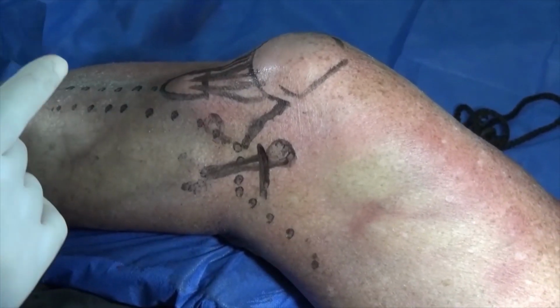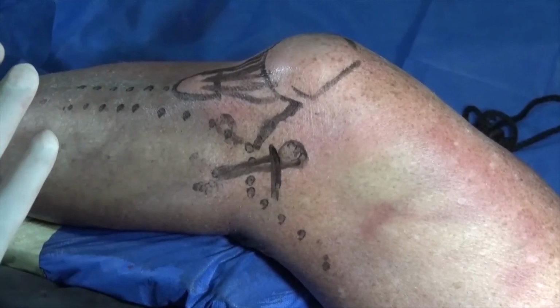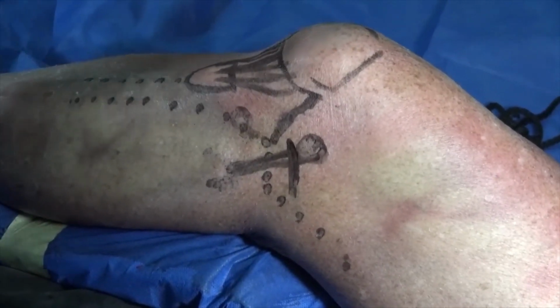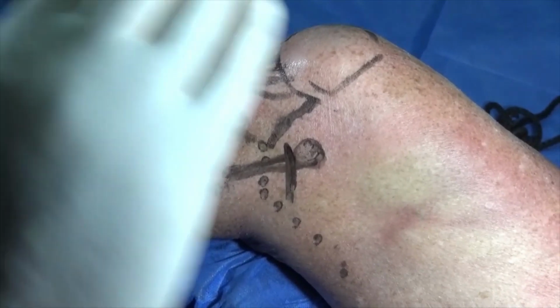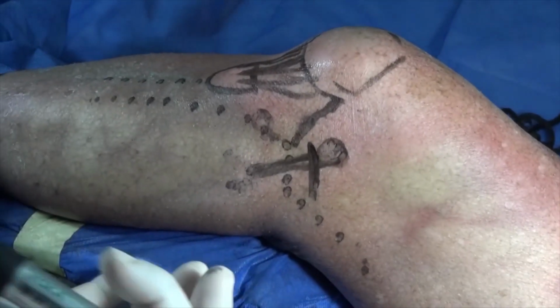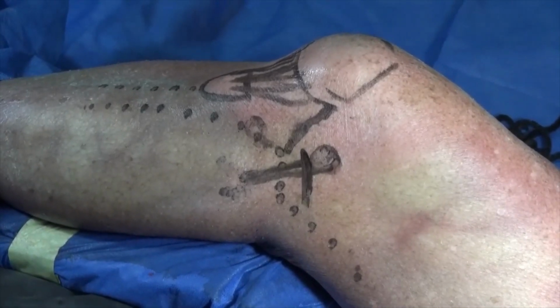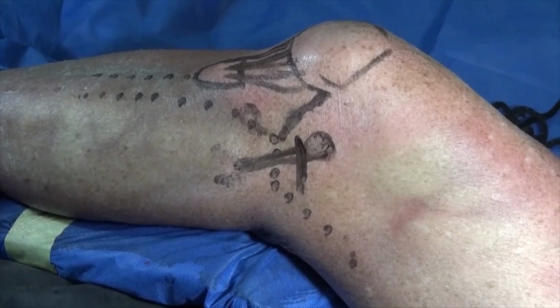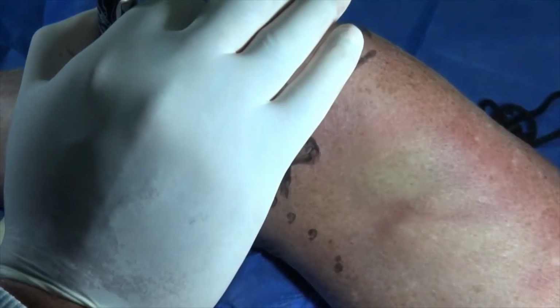So what we're going to do now is the first straightforward part, which is what most of you need to do for an anterolateral fracture. The extension, where you extend it, is only needed if you have a posterolateral fragment. Are we clear? Good.